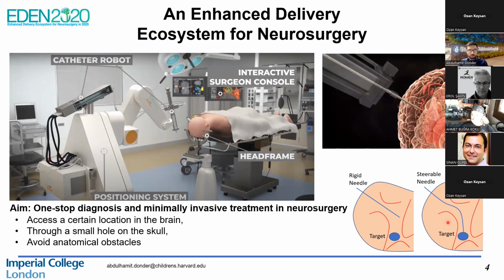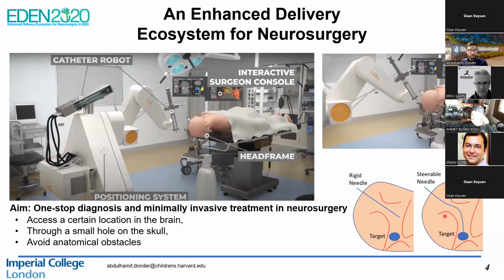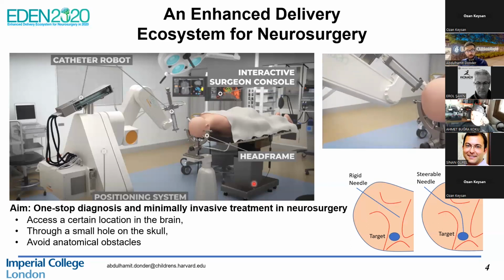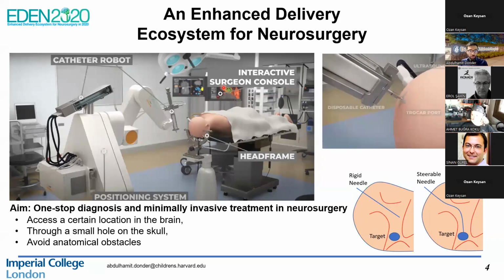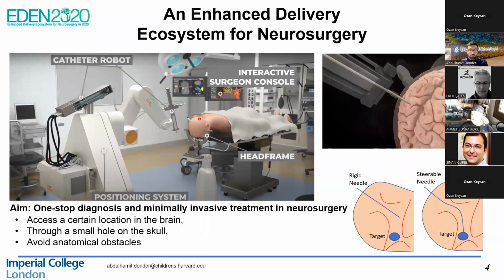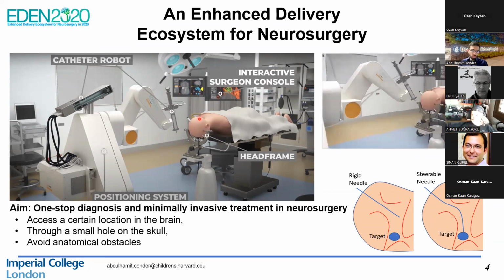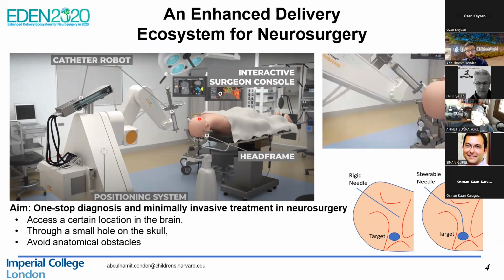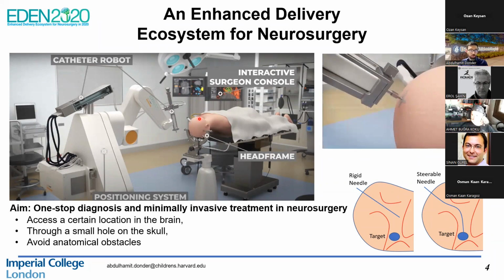Therefore, a steerable needle was developed, and to make it intuitive to use for the surgeon, it was integrated with robotics so that they could use a joystick to navigate the needle by utilizing a graphical user interface as illustrated here. So now let me give a brief overview of steerable needles and present a bio-inspired steerable needle that was developed in our project. I'll then talk about our shape sensing methods, path following control methods, and our animal experiment with this system.